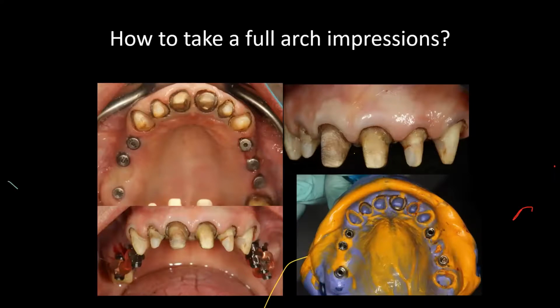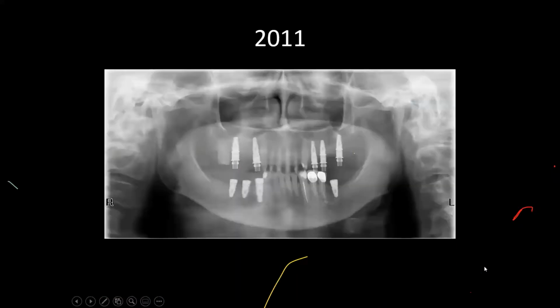You can see I maintain the tooth on the upper left side. We did lose an implant, I think the middle one here. I remember this case. That's one of the reasons sometimes you place 3 implants, because in this case I wasn't too sure about the bone softness and density, and I said, I'm not quite sure about this, but nevertheless 2 would be adequate to restore this patient. The impressions are taken at the implant level. Both arches, upper and lower, were placed all at the same time.